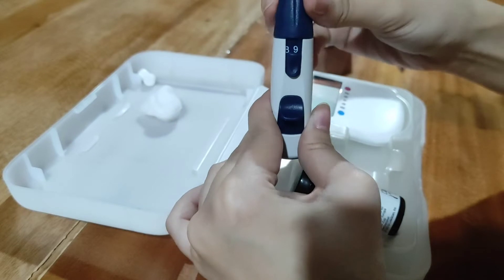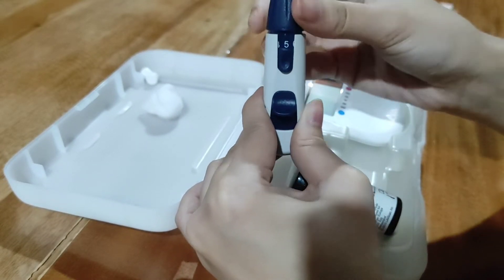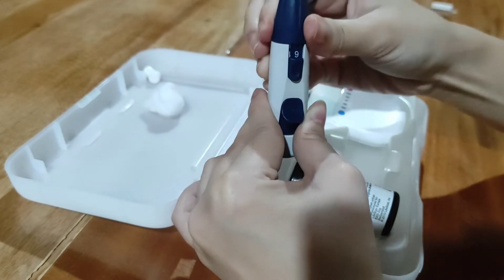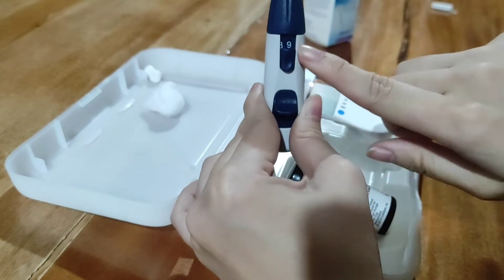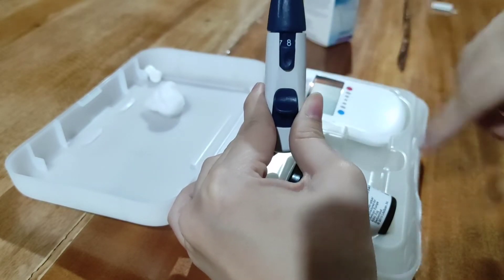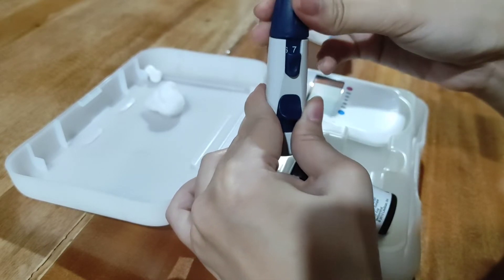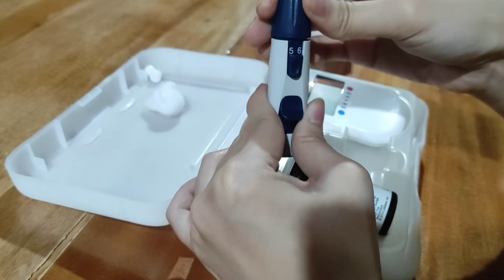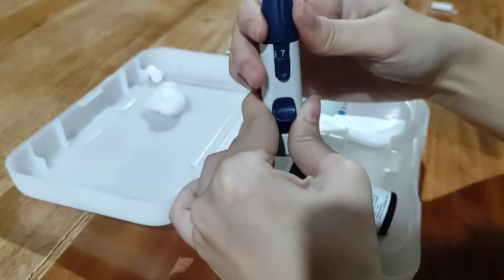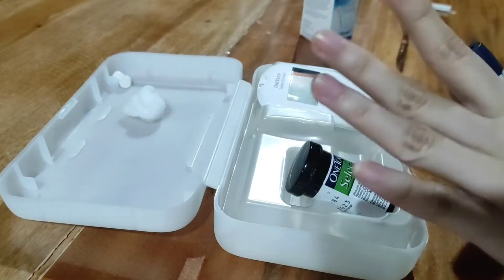Ito yung mga number dito — yung matuturn — yan yung kung gaano kalalim yung lancet device na mag-penetrate sa skin. Usually ginagamit yung eight and nine sa mga boys kasi mas maano yung skin, and yung sa mga teenager or girls naman it can be six, seven, five, or four.